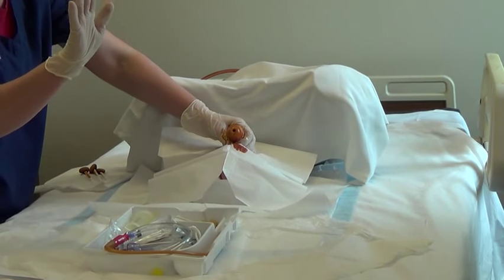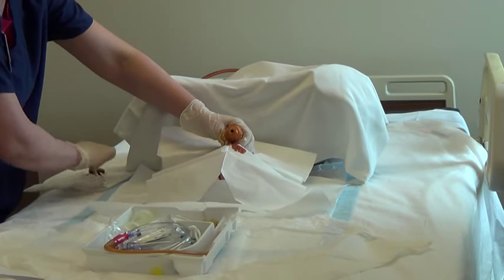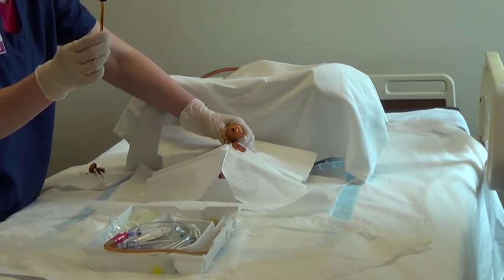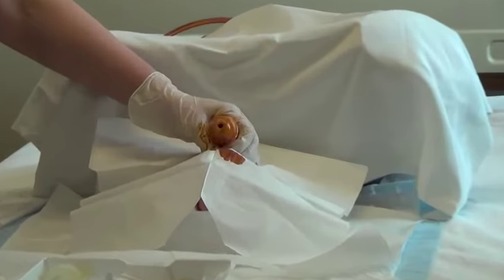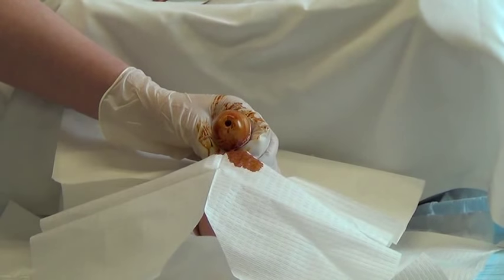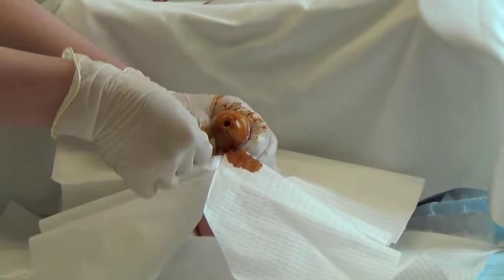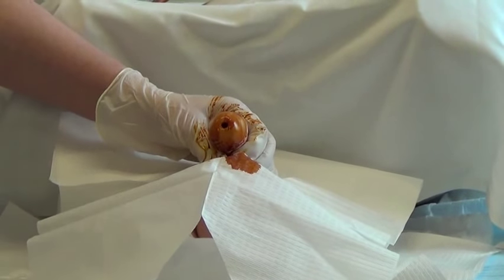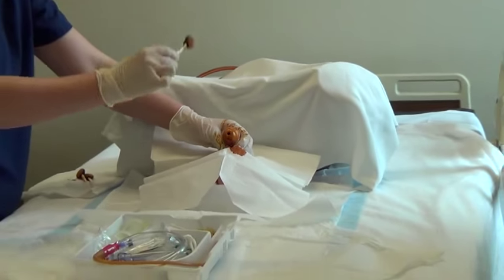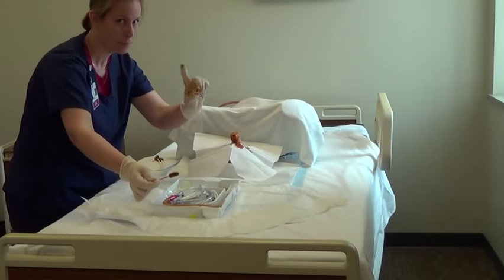We will now show you some common errors in cleansing with the swab sticks for the male patient. To avoid breaking aseptic technique, avoid doing the reverse corkscrew, painting, or smushing. Do not discard your dirty swab sticks by reaching across your sterile field.